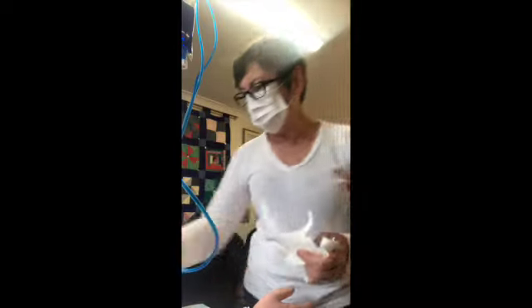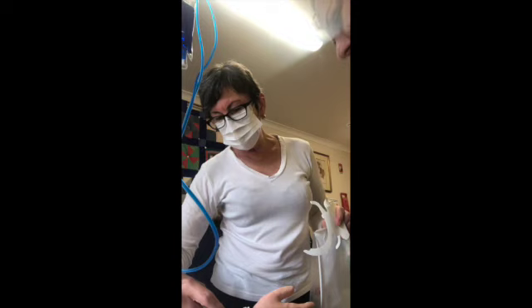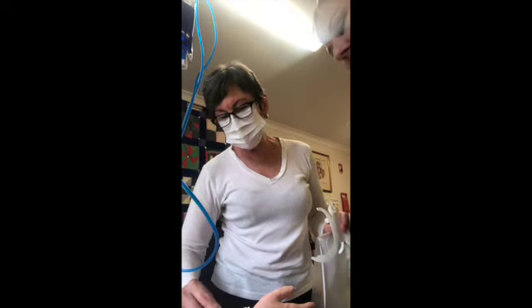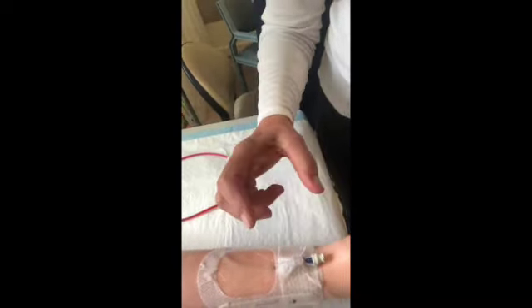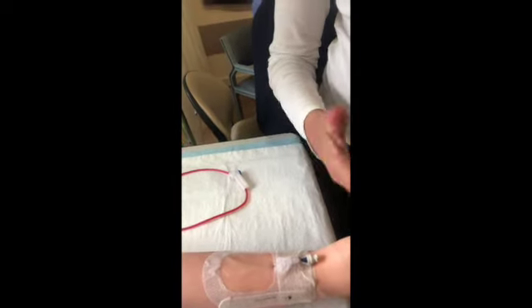Beautiful. How you going, Jen? I'm done, Steve. This is what I've done. I've put the primary dressing over the cannula so I can see the insertion site. I've put the secondary part over the bung and the cap so that if there's any issue you can take that off and change the bung or whatever, and then I put the date sticker there.